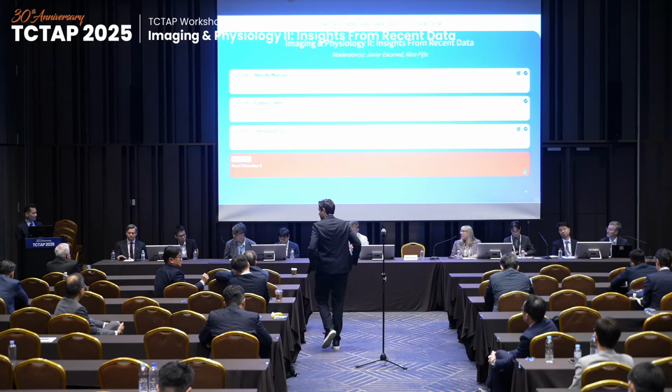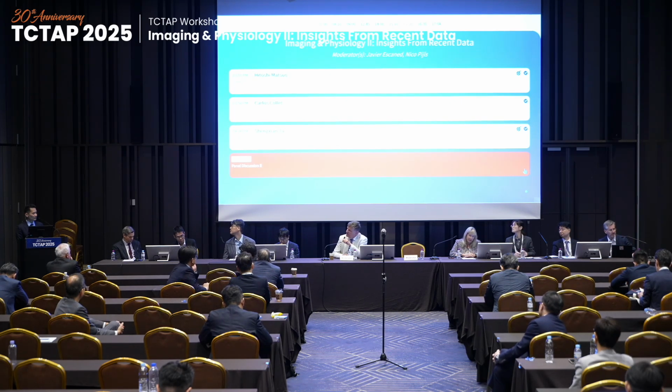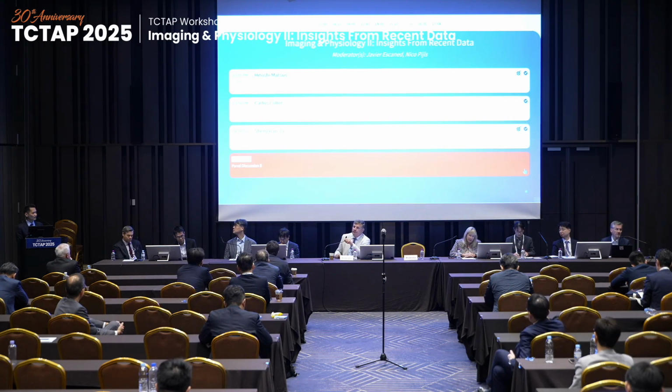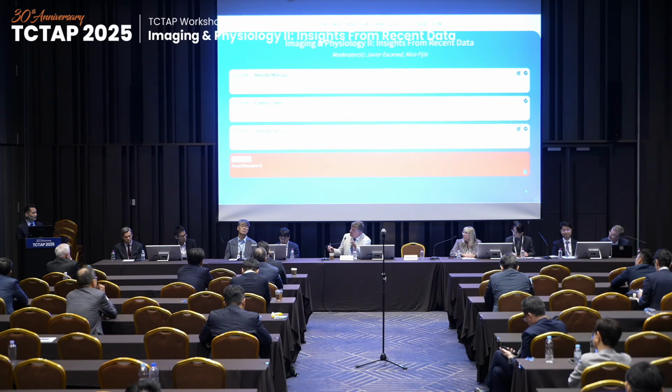Dr. Tu, you discussed both Angio-FFR and FFR by CT, isn't it? For my feeling, there is a fundamental difference, because FFR by CT, which is not optimal either, is truly non-invasive. So I think there's a fundamental advantage, and I can expect that you have lesser demands on such a methodology than on an invasive methodology.